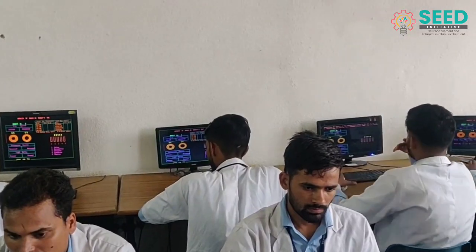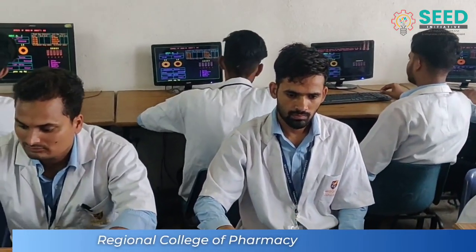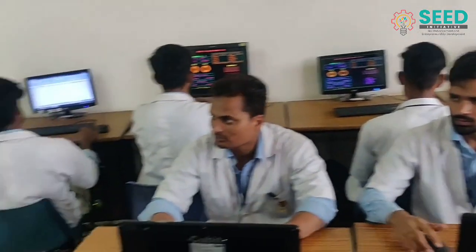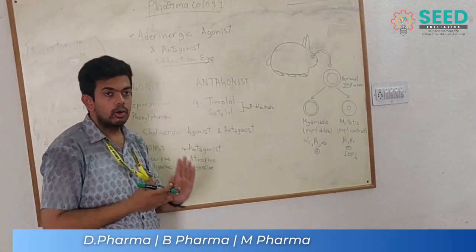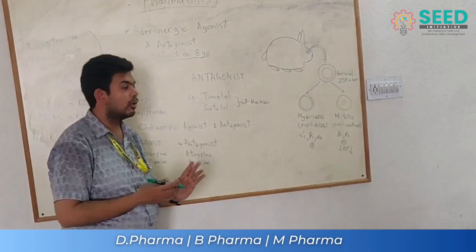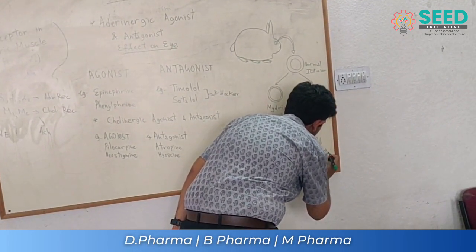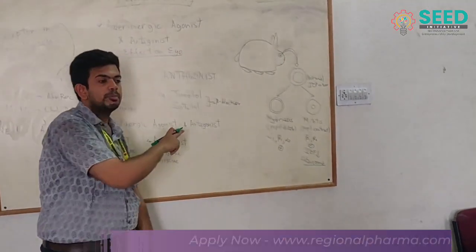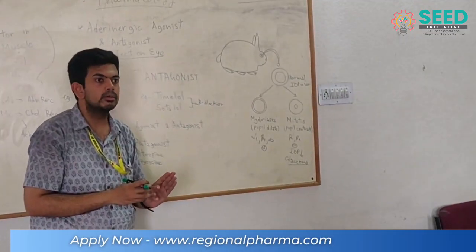It is written that light reflex and intraocular pressure is decreased in both. Yes? Yes. You can see that. So what does it mean? It means that beta blockers also decrease your intraocular pressure. Timolol and sotalol come in eye drop preparation in the market, which is given for glaucoma. Both of these come in eye drop preparation for your glaucoma. In Hindi, glaucoma is known as kala motia bind.